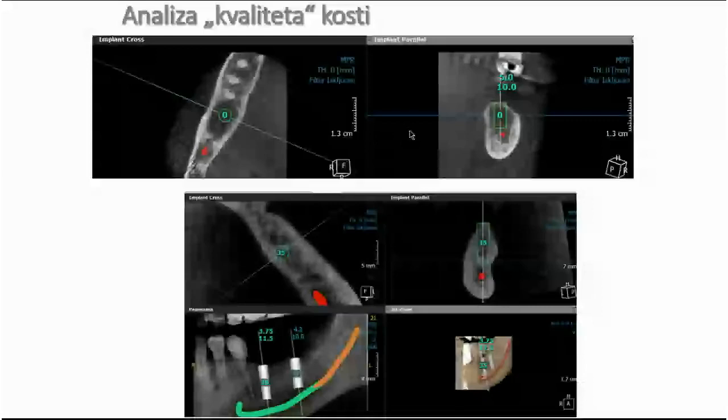And in which direction will it direct us? It will direct us to probably use a less aggressive instrument to prepare the implant bed, or to use an instrument with the possibility to do an osteodensification process during the implant bed preparation.